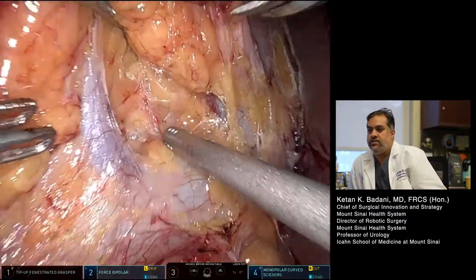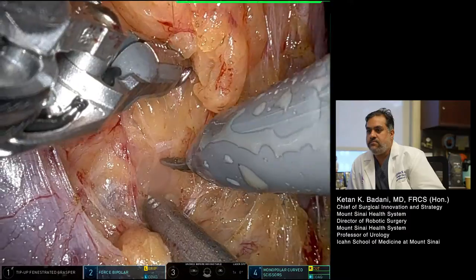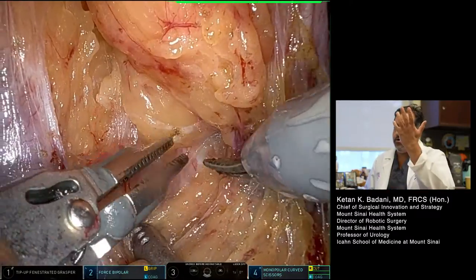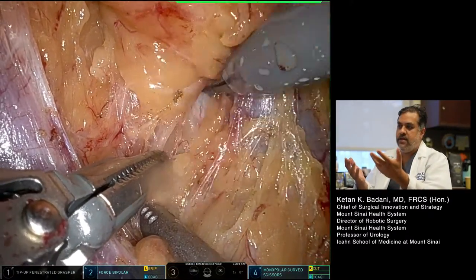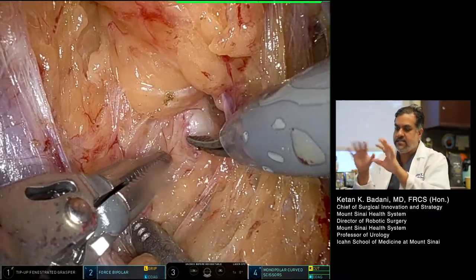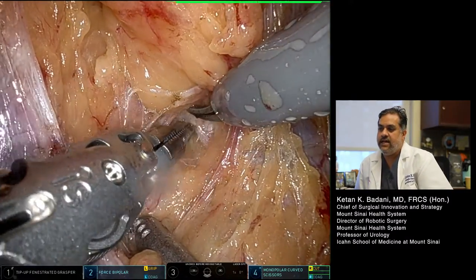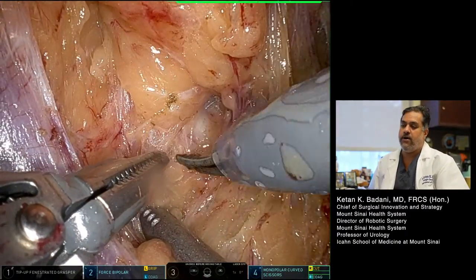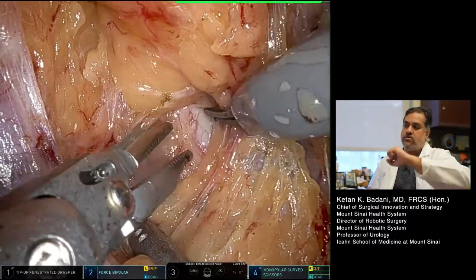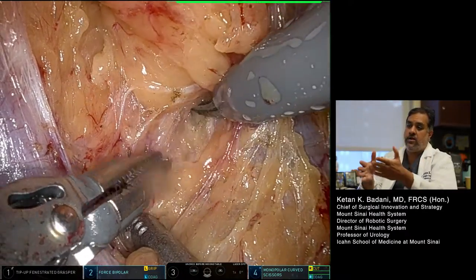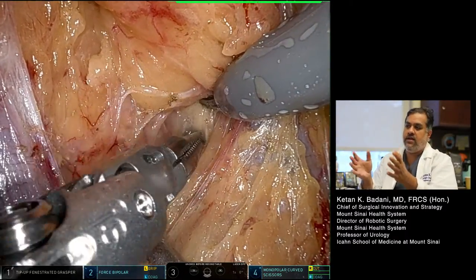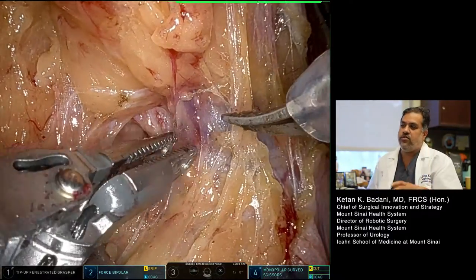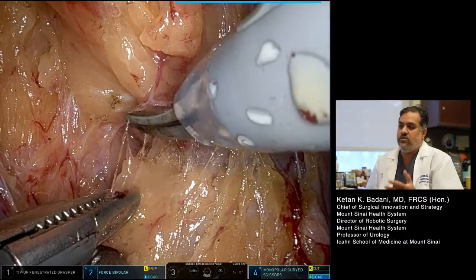Now the hilar dissection. You see the two renal veins. This tip-up retractor is very nice for hilar dissection — that upward grab lets you operate with both hands and you don't have to use one hand for retraction. One of the things that laparoscopic surgeons have appreciated about robotics is that in laparoscopic surgery you're always using one hand to retract and dissecting with the other, whereas with the robot you have both hands to dissect with. Once you use a fourth arm for this step, you'll always want to because it's so nice to have two hands for dissection.